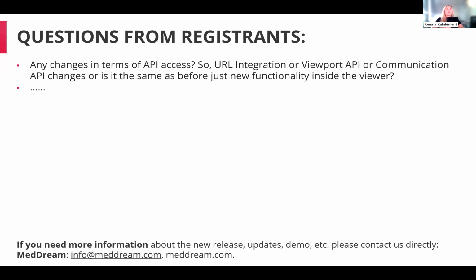So a question is, any changes in terms of API access? So URL integration or Viewport API or communication API changes, or is it the same as before, just new functionality inside the viewer?